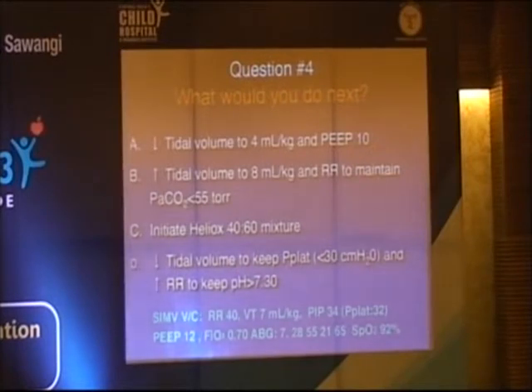And almost certainly you would also increase the PEEP. So you want to get those alveoli recruited, and based on that FiO2 PEEP ladder, a patient on 70% oxygen should probably be on 12 or 14 of PEEP, not 10.